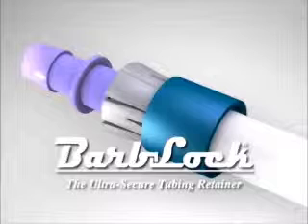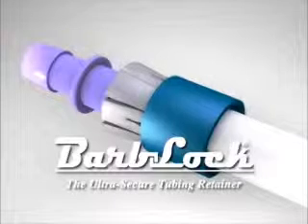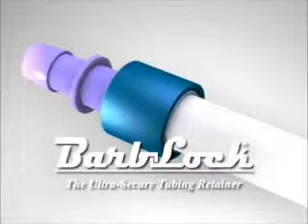You've just seen the successful assembly and removal of our Barblock ultra-secure tubing retainer. For a full margin of safety, use Barblock.